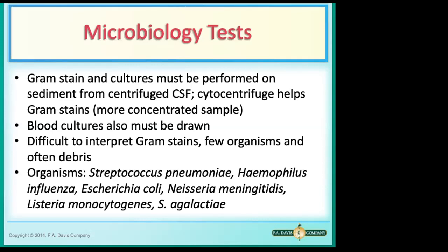the reason why microbiology gets these tubes of CSF is to really identify the causative agent of meningitis, because meningitis could be a very, very dangerous condition. It could be fatal. Okay, so bacterial meningitis, most likely could be very fatal if it's not caught in time, and it can be very dangerous for the patient. So we do some microbiology tests on this tube for CSF to identify different types of organisms.